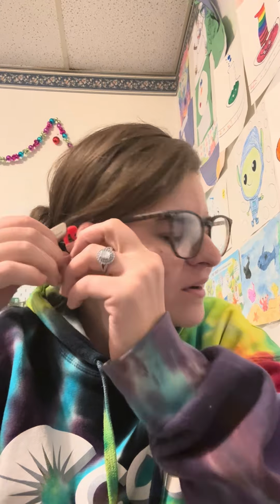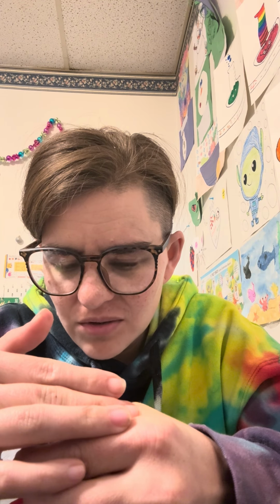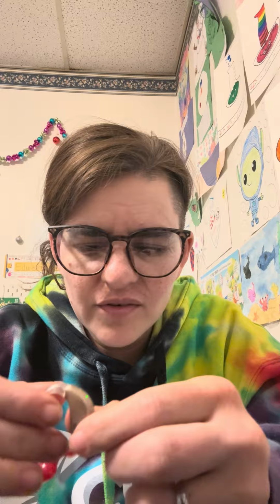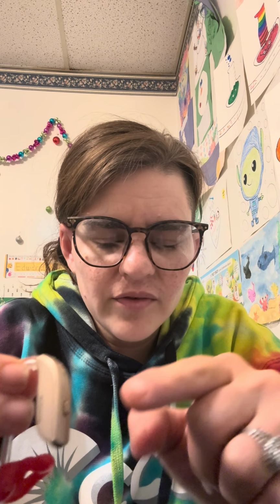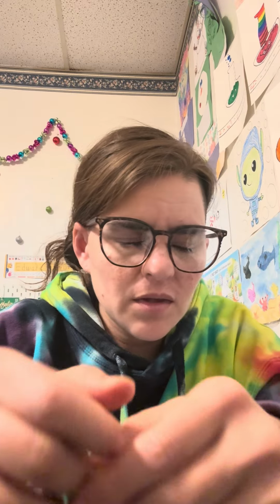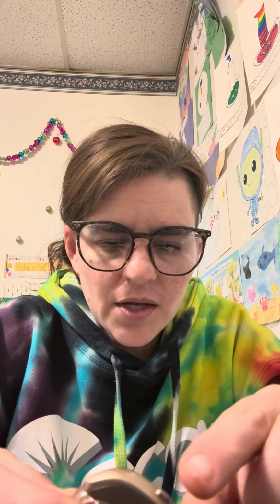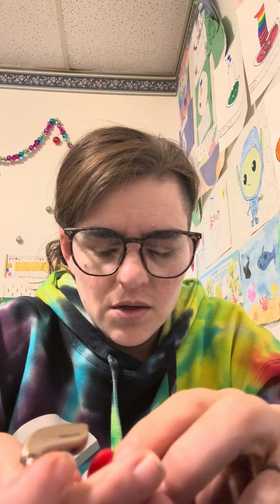It is so weird. I had occlusion. If anybody doesn't know what occlusion is, that's the ear plugging feeling, like when you wear earplugs. So in order to shut off your hearing aid, for this particular BTE, you hold down the button till the light goes off, and then when you go like this, you won't hear any feedback, like static or squeaking. And then to turn it back on, you push the button again and hold it until the light comes back on.